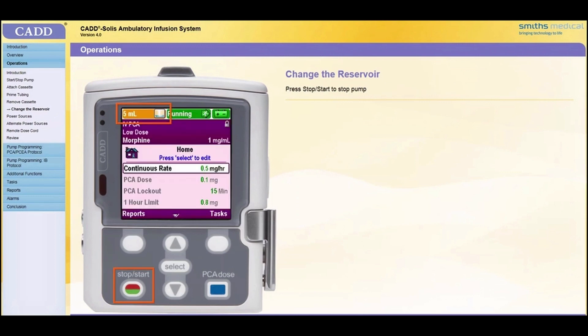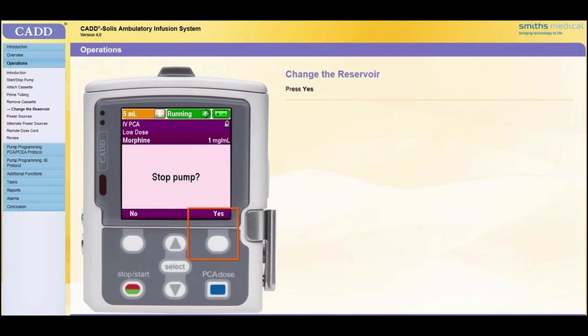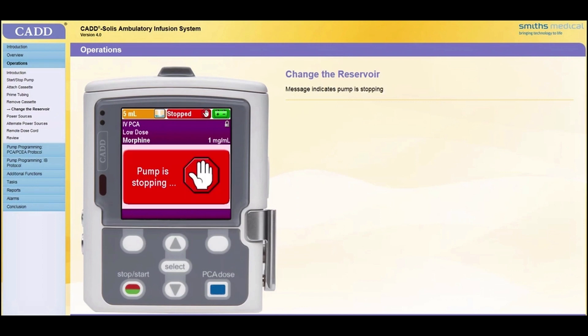Stop the pump by pressing the Stop Start key. When Stop Pump appears, press Yes. A message appears indicating the pump is stopping.